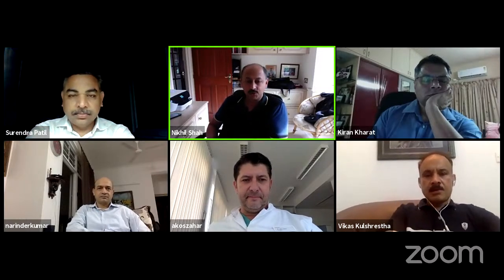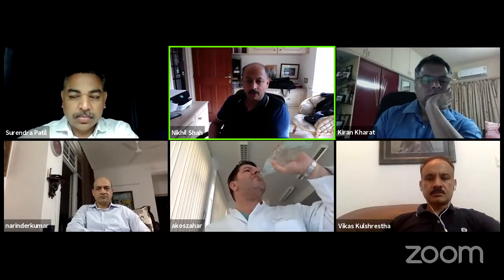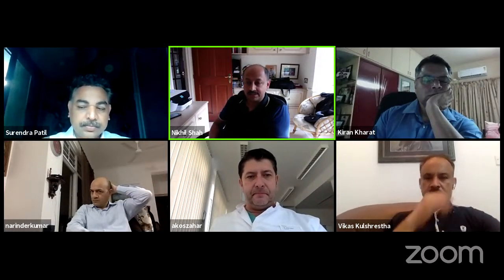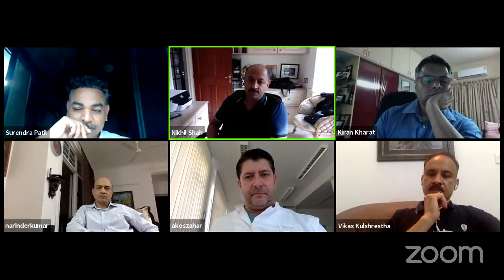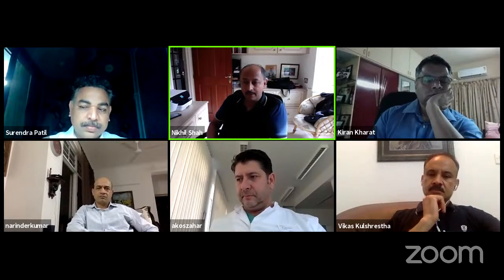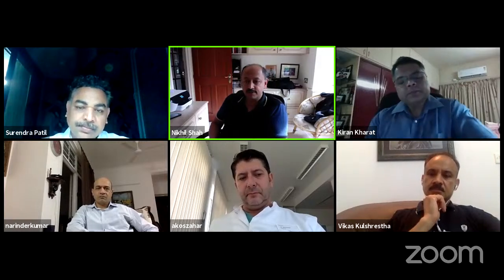We also did an audit of Synovasure, like you said, the alpha defensin. We did not find it very useful for confirming infection and changing the treatment plan. But where we found it useful is to exclude infection during theater, if you are not decided whether you want to do a one stage or a two stage. The second indication is if you have a painful total knee replacement and multiple attempts to exclude infection have been unsuccessful. There are 20% of patients who are unhappy with their knee and you don't really want to operate. A negative Synovasure helps you decide not to operate, because the chances of making them better are very low. So in these two situations, we have found it very useful.